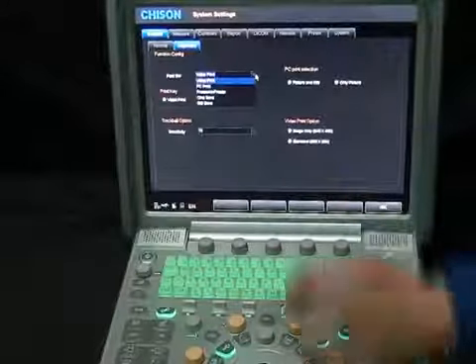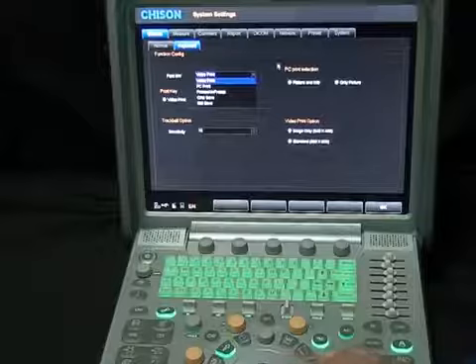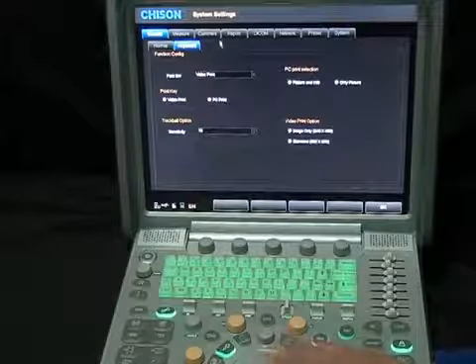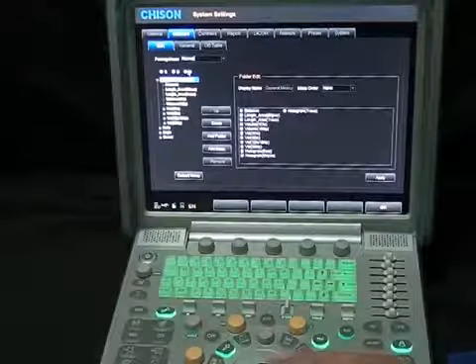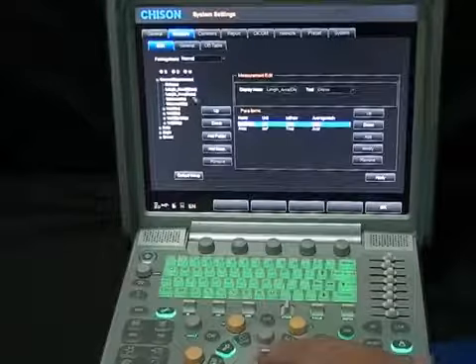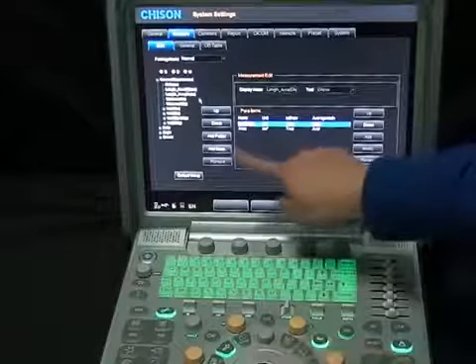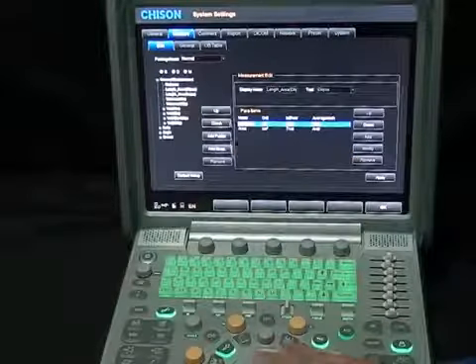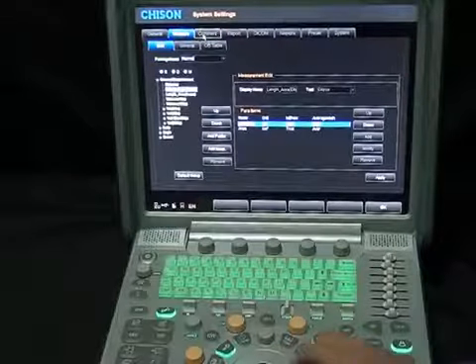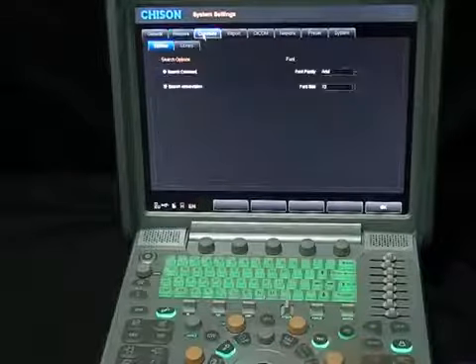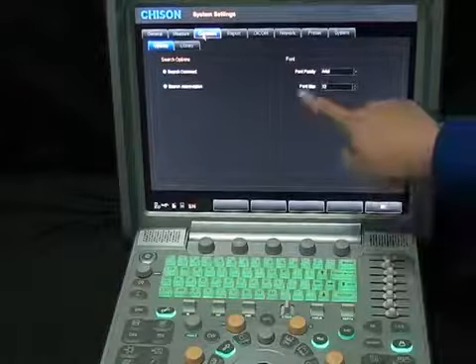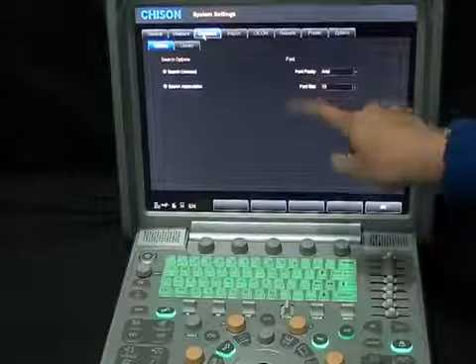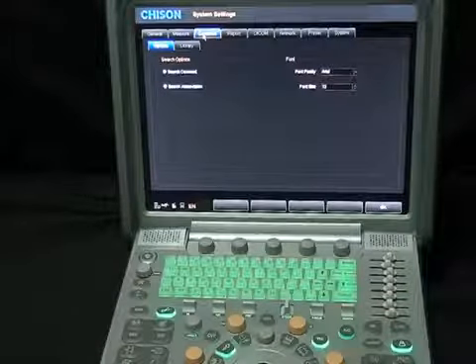In measurement, user-defined settings are available. We can add measurement parameters and formulas on each probe, each preset, and each mode without number limitations. In the comment interface, you can add or delete comments for each preset, and set the font and font size, making your comments look specialized.